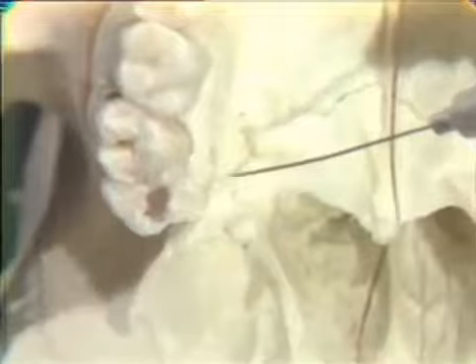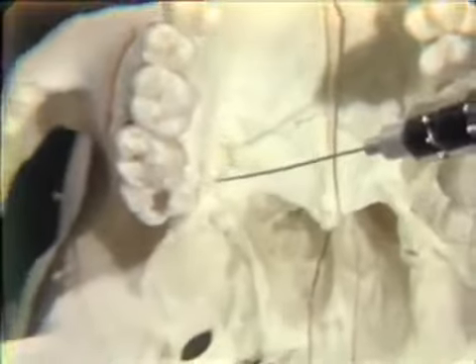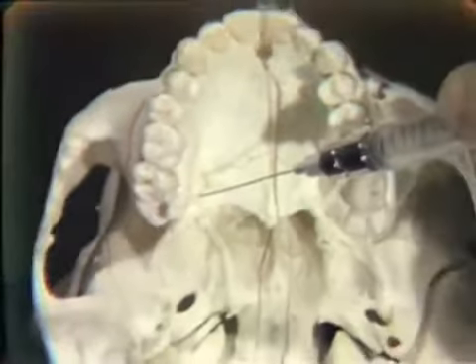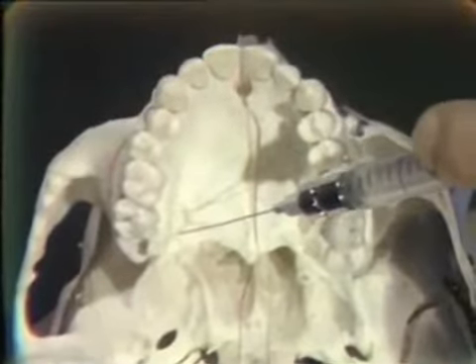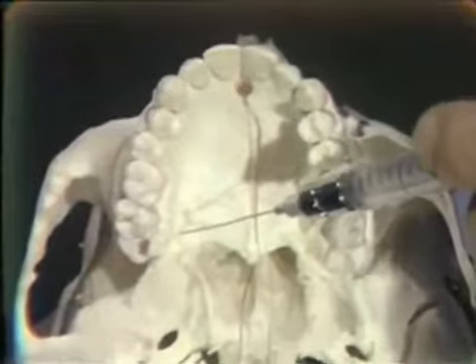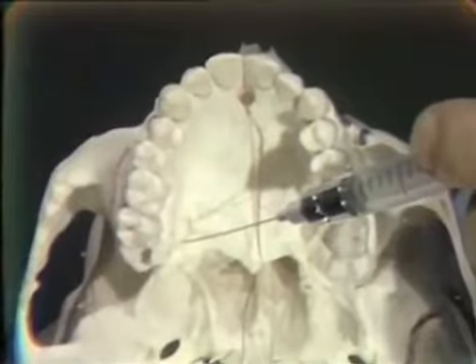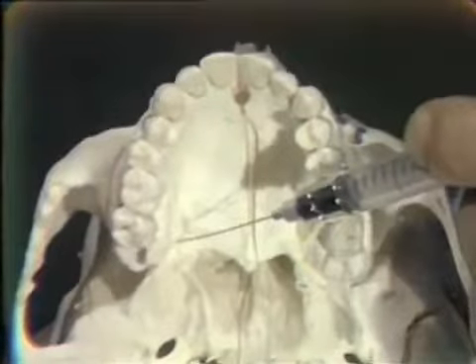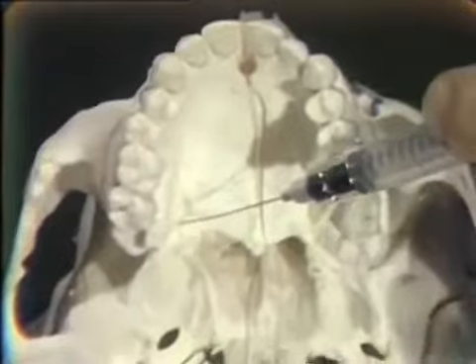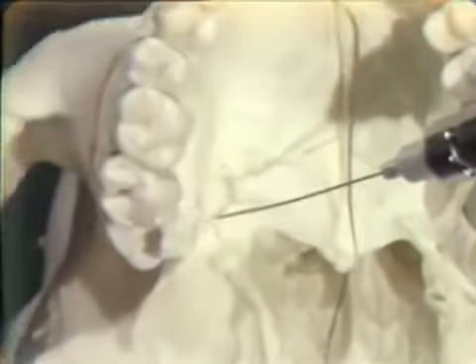We deposit just a few drops of solution after aspirating, and you'll find again that with these palatal soft tissues, due to their fibrous nature, it is difficult to expel solution from the syringe into the tissues, and you have to bring to bear quite a little pressure on the plunger to do so. You will normally see the tissues blanch in this area due to the vasoconstrictor in the solution. As you observe this, you will know that you have got a few drops at least of solution out into the tissues here just anterior to the foramen. Ideally from 1/4 to 1/2 cc of solution, if you can, injected at this site.